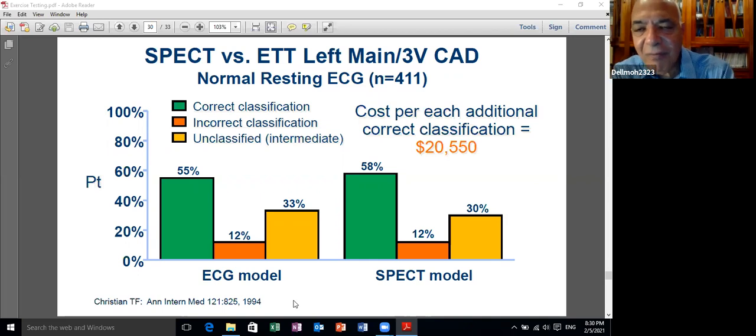فكان فور ذا سيك اوف بريفيتي وايزينس انك انت تحط في 4 وفي 5 وفي 6، لكن لا، هو 12 ليدز او 15 ليدز. بعض الالكتروكارديوجرام ممكن تعمل 15 ليدز لغايه دلوقتي، وبالتالي تحصلي على الماكسيمم انفورميشن بوسيبل.